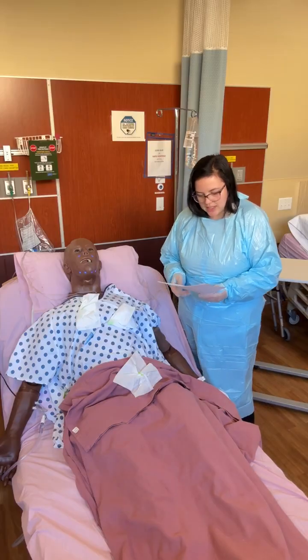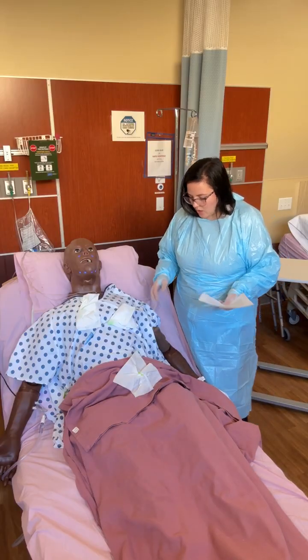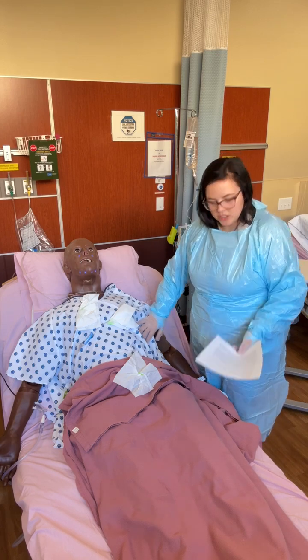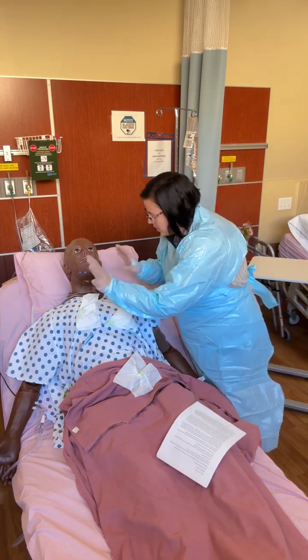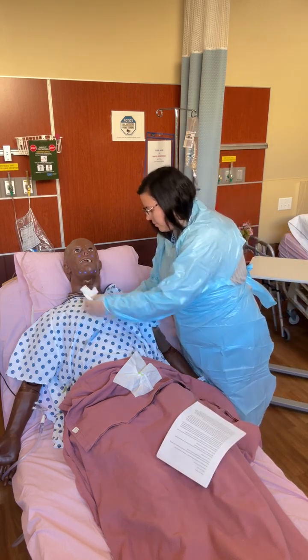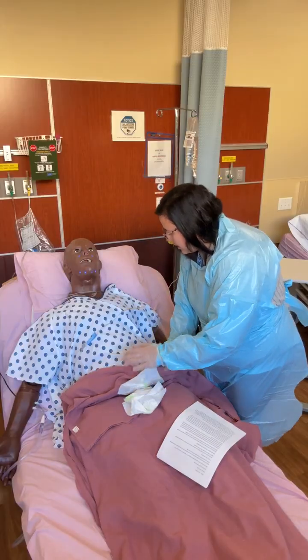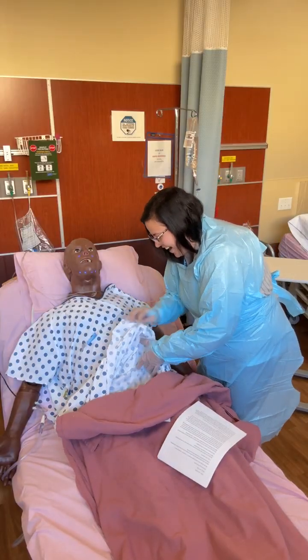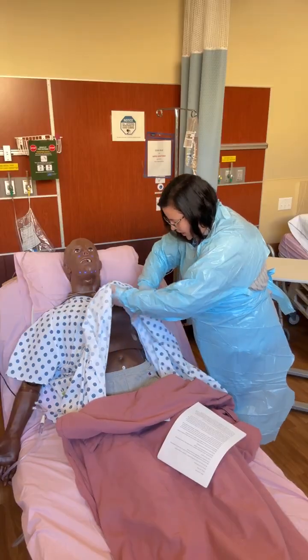To obtain your patient's apical heart rate, you are going to actually remove the patient's gown so that you can get onto the patient's skin. So you can just talk to the simulator or the patient. Stan, I'm just going to listen to your heart rate here. I'm going to lift up your gown here. Expose your chest.